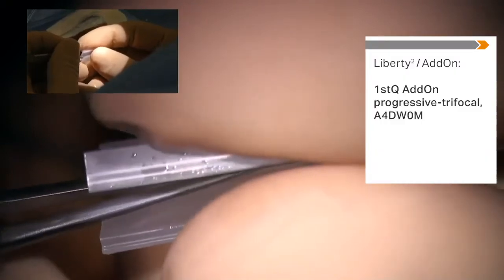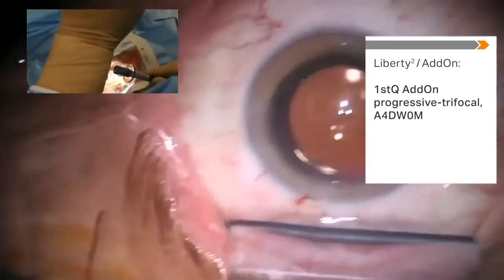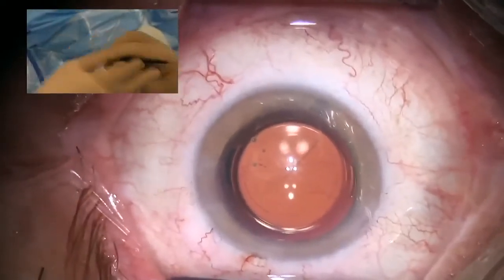Okay. Again, the add-on IOL in the Liberty system: the proper alignment of the IOL in the cartridge, folding backwards, avoiding the incarceration of the haptics, slight pressing down. If you hear this clacking noise when you close the cartridge, then you are on the right side. If you don't have a noise, then you probably have an incarceration of a lens particle.